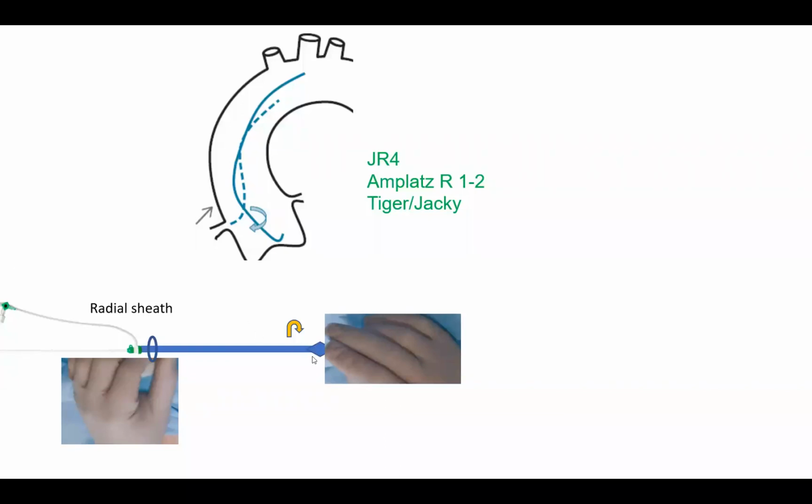And this is, like I explained in the past, how we torque catheters for coronary engagement. Both your hands are on the catheter, one on the front, one on the back. And both hands do that torquing maneuver 90 to 180 degrees as you're pulling the catheter. You want to see that torque being transmitted as you're torquing it. You don't want to see that torque getting stored.